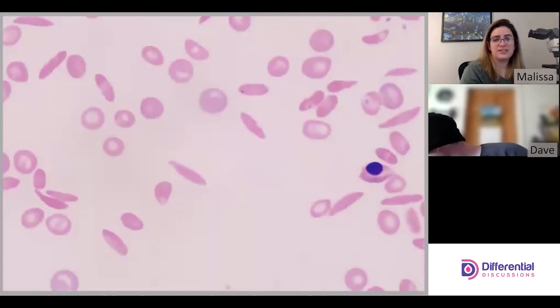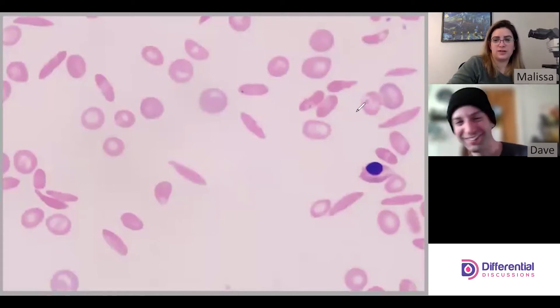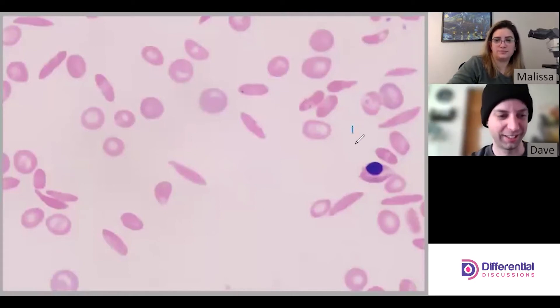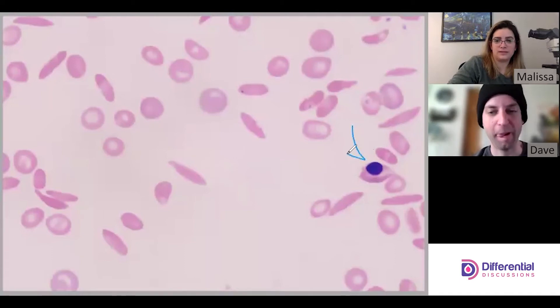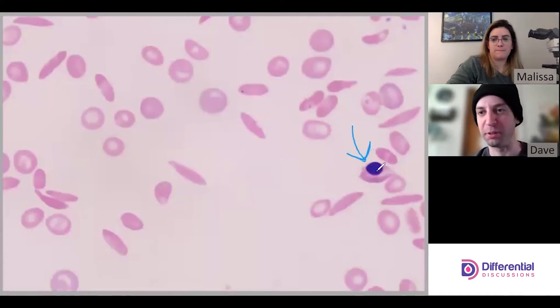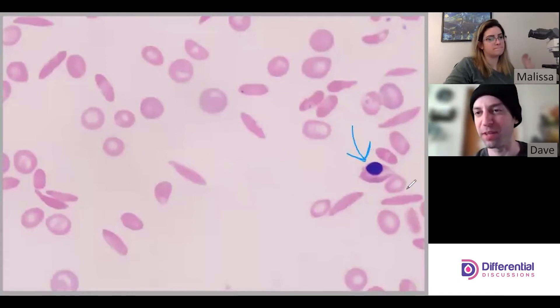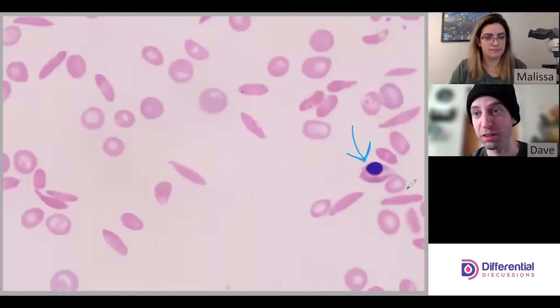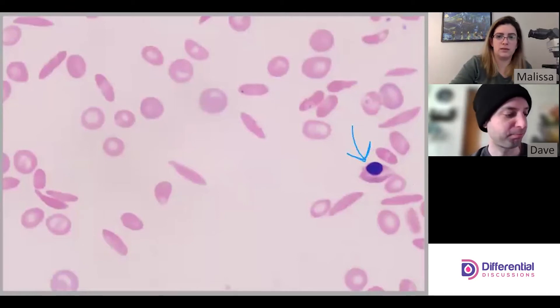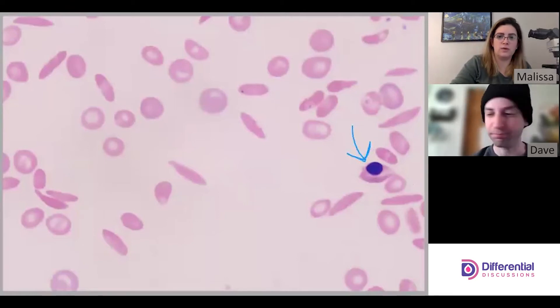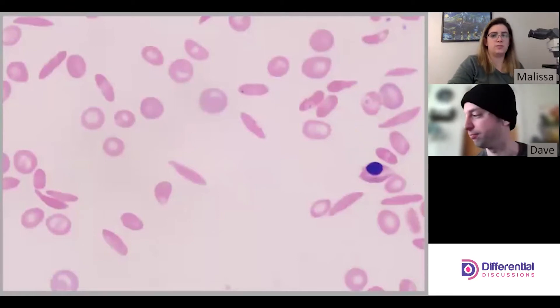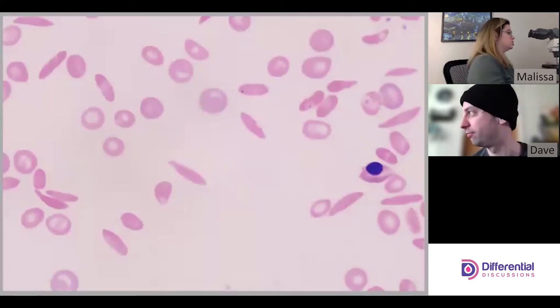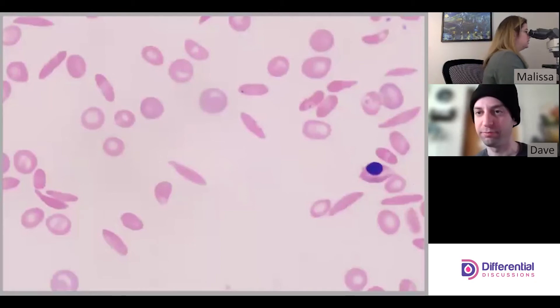This is another nRBC over here. We're just keeping track of how many we find — we're at two at the moment. We would just keep trucking along doing our differential and see how many we find.